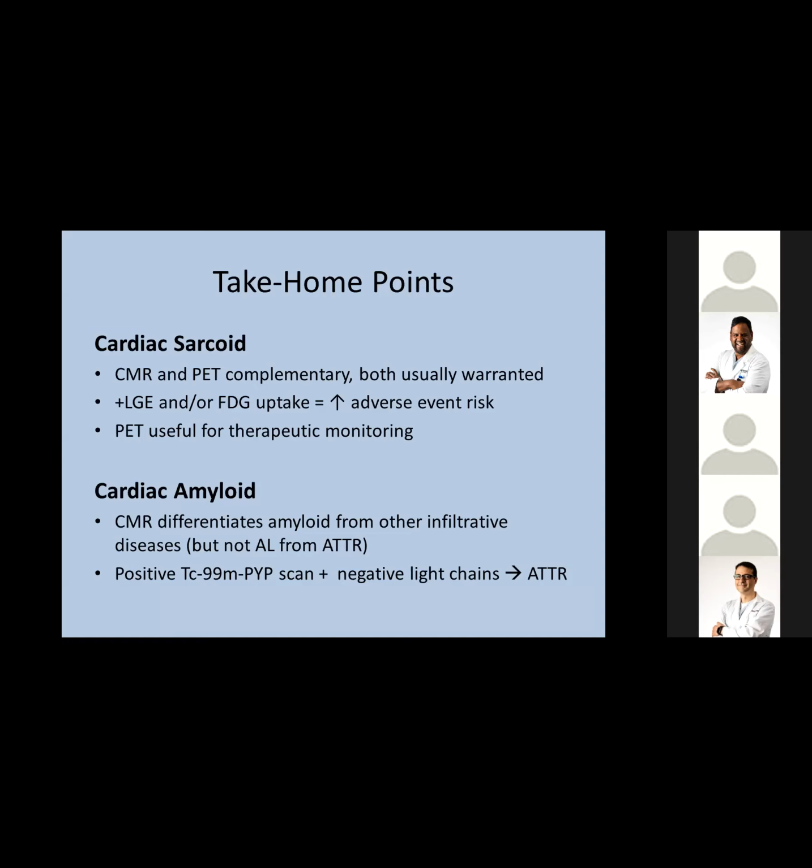LGE and FDG uptake in the context of suspected cardiac sarcoid do correlate with an increased adverse event rate due to higher rates of ventricular arrhythmias. And then PET is the one that we use for monitoring. So there's really not much of a role for MR in therapeutic monitoring, whereas PET is used routinely.